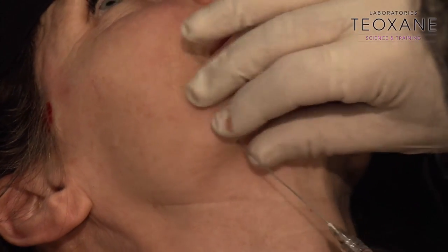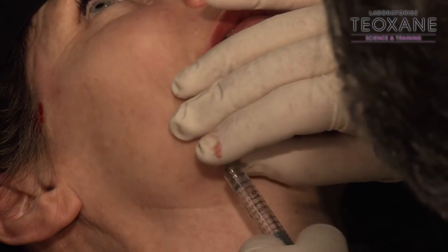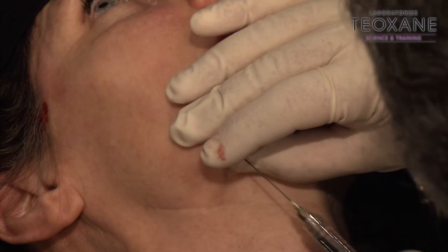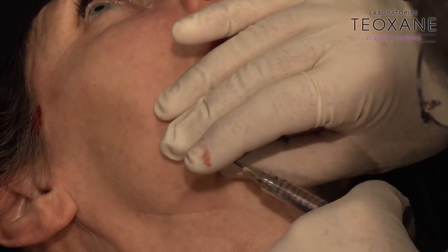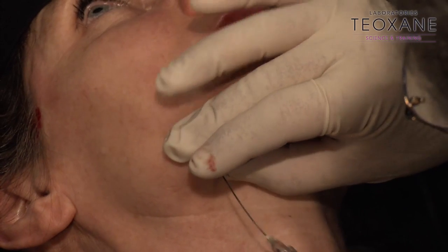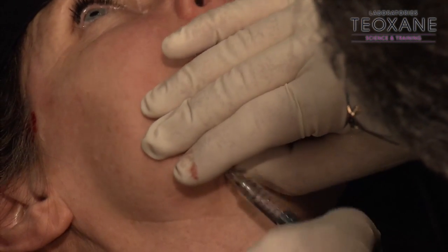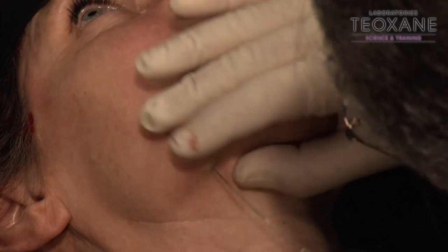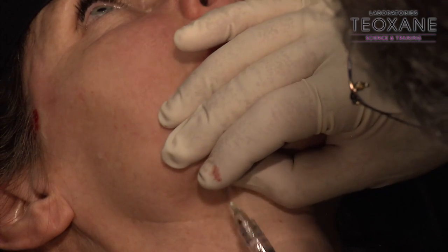As I always said, when you put fillers, you are inserting fillers between the skin and the muscle, which I used to call the wallpaper technique. It's like if you want to glue some wallpaper on the wall, you put the glue in between. So the gel is the glue between the skin and the wall, the muscle. If you put too much, you're going to be bubbly and uneven. You want just the right amount, not too little. It's okay, darling. Voilà. So fine.